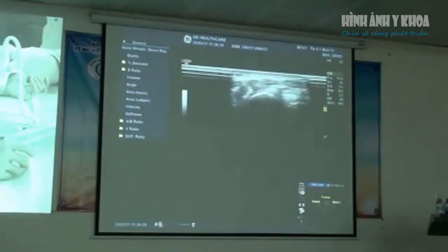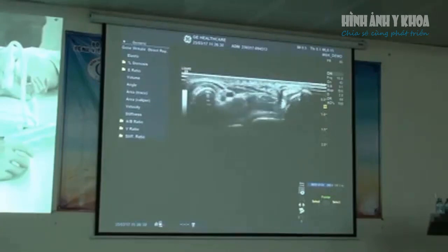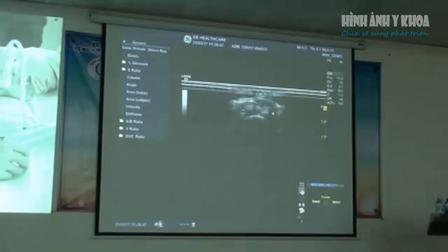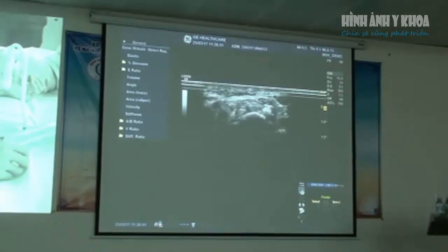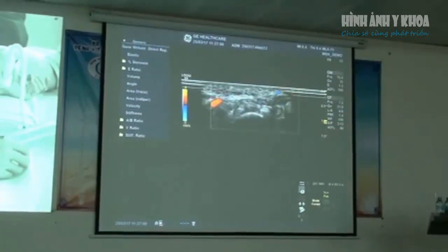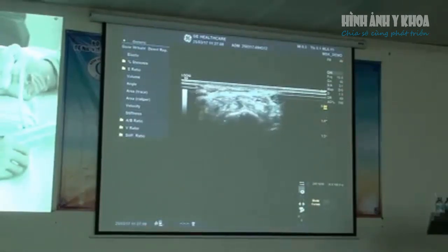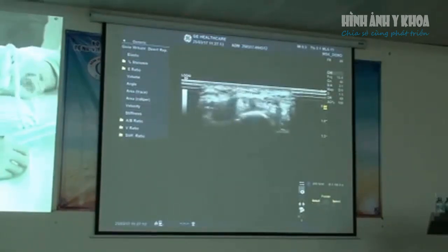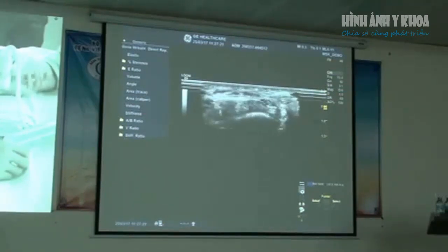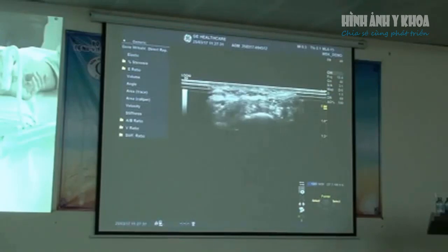As we come up and over, this is at the point of the carpal tunnel. We've got the pisiform and then the hook of hamate and the flexor retinaculum sitting over the top. We use color in the carpal tunnel just to make sure there's no persistent median artery. I get the patient to wiggle their fingers and watch the nerve to make sure it's moving around quite freely. With patients with carpal tunnel syndrome, the nerve becomes quite thickened and becomes stuck in the tunnel, so it doesn't move.